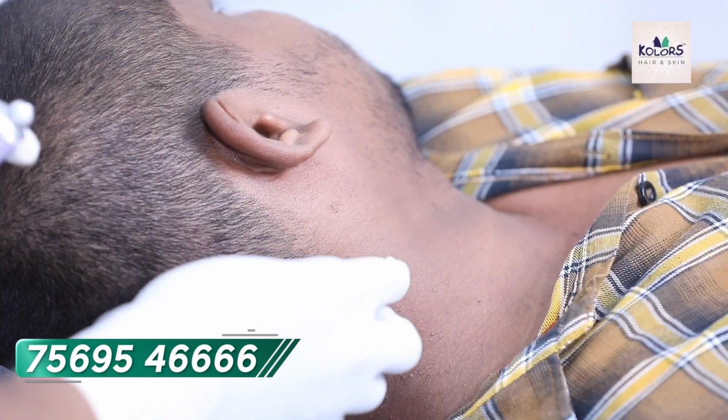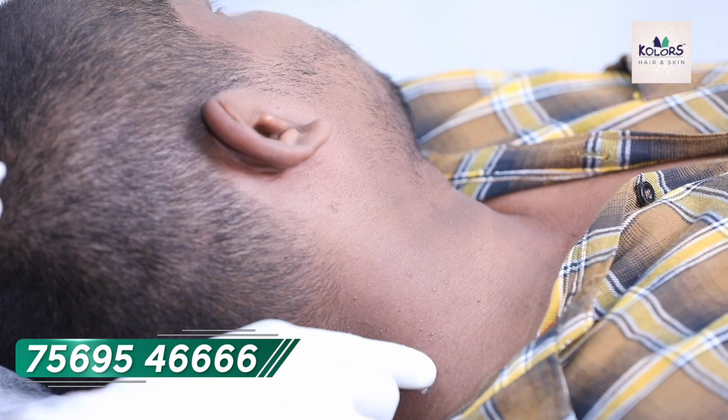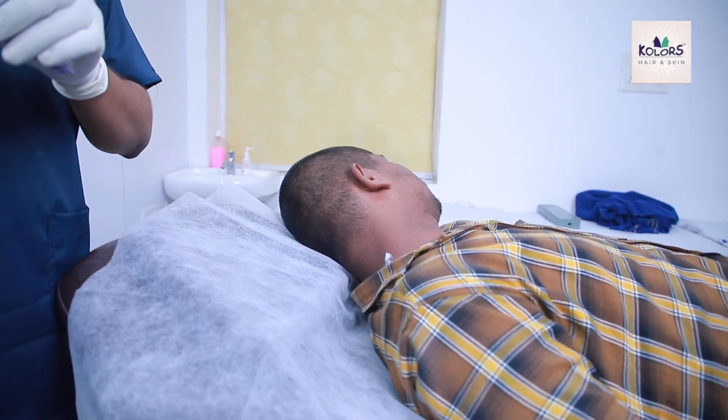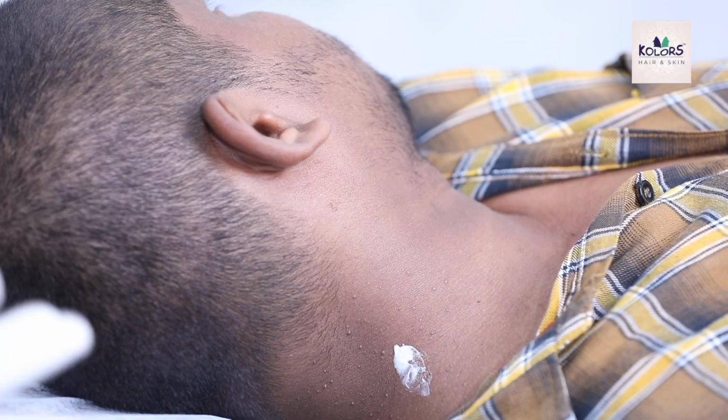Usually there are different types of electrodes, that is needle type electrodes, loop type electrodes, and elliptical type electrodes, depending upon the indication for which we will be using them. If at all some bleeding occurs, we will also have the coagulation probe, which should be very useful.